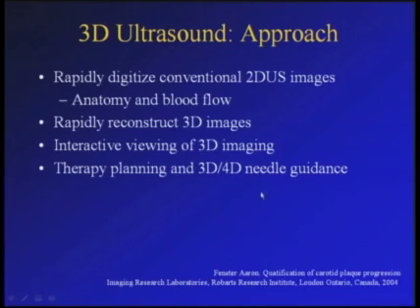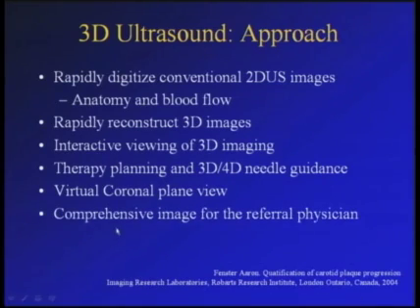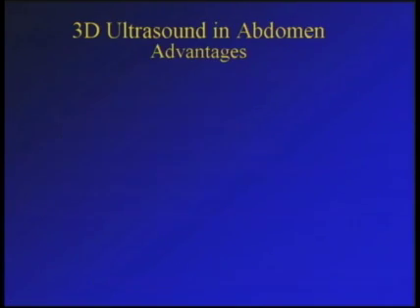And we can do needle guidance in 3D and 4D, permitting us to do therapy planning. And 3D ultrasound offers a virtual coronal plane view. And a comprehensive image is obtained for the referral physician.